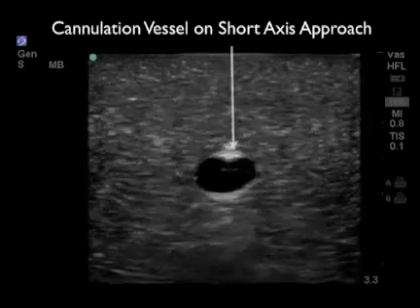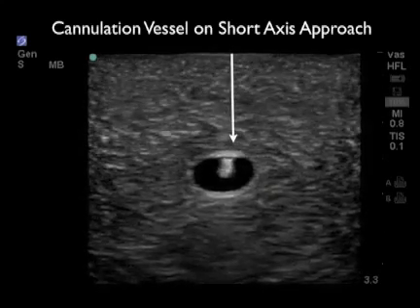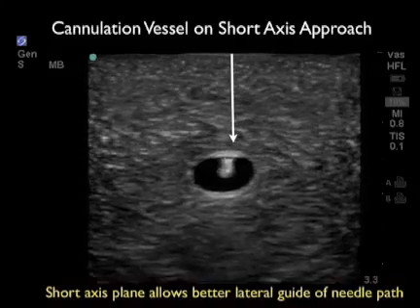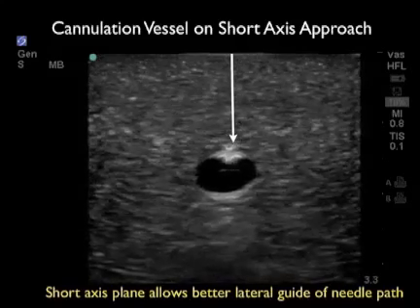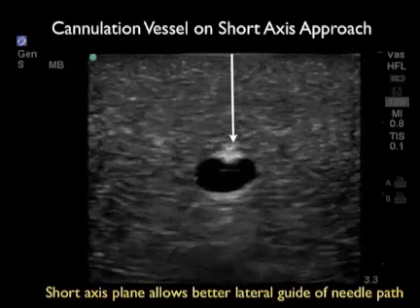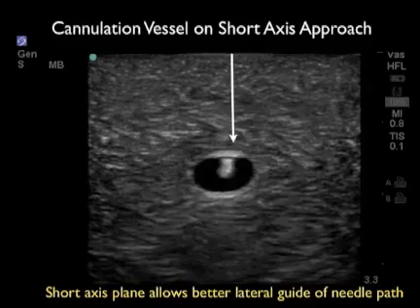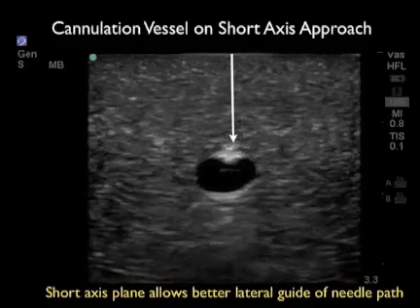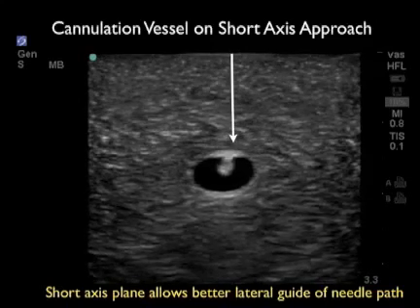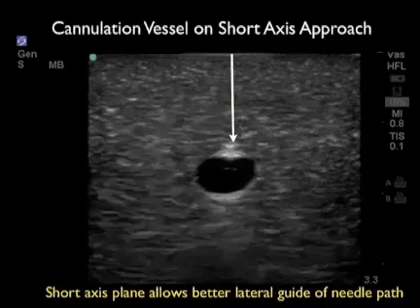This is a phantom which simulates the human body, and we can see that as we place the probe in the short axis orientation, the vessel will appear as a circle end on. Notice here that we can see the echogenic tip of the needle coming down to the vessel, penetrating the anterior wall, and then entering into the lumen of the vessel. So the short axis plane allows better lateral guide of the needle path and is a good starting position for cannulation of an axillary vein.